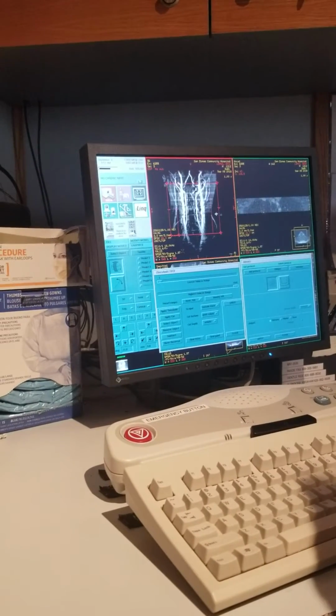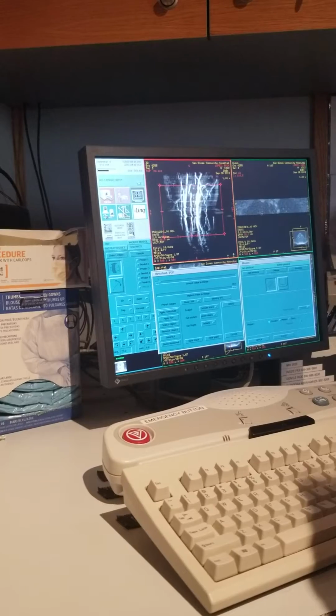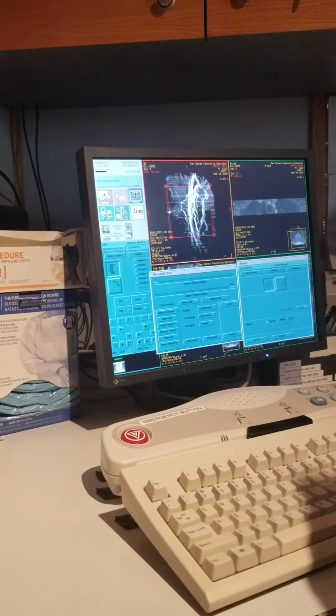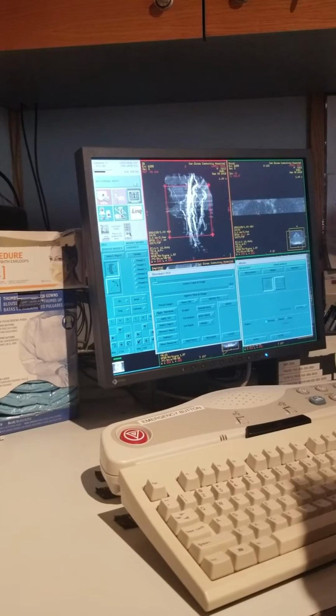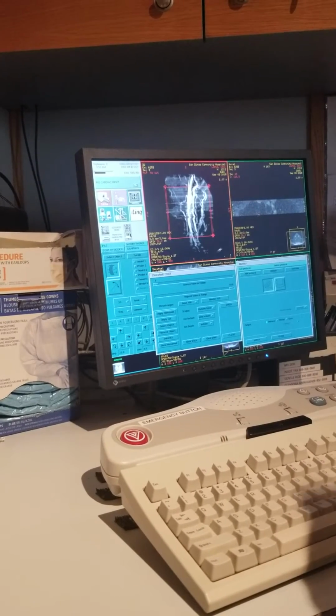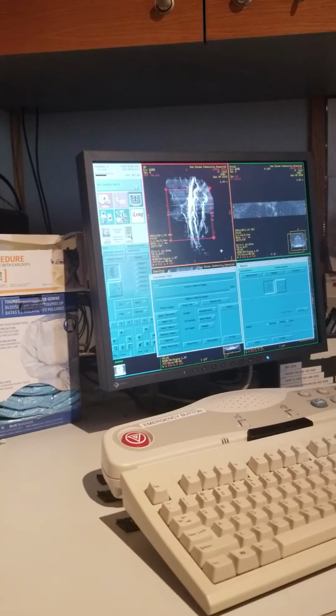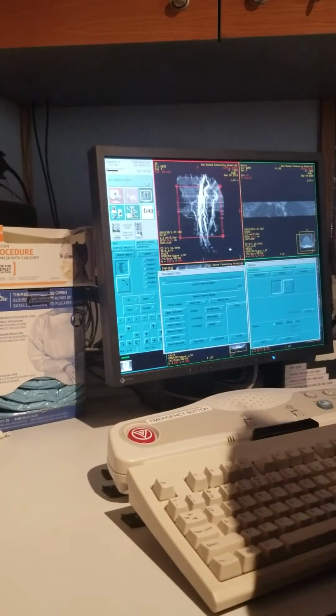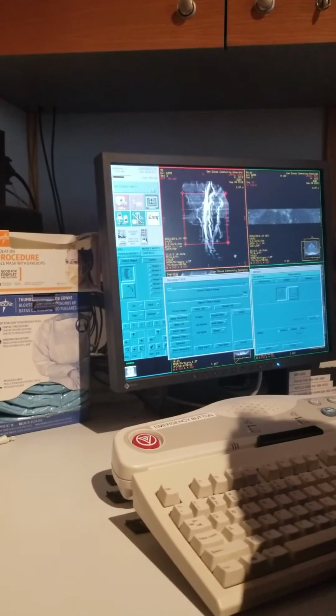That's what you're going to cut out. A lot of times at the sites, you'll rotate and tumble the complete system, and then you'll cut just the right common carotid and the left common carotid by itself, without the other side or without the vertebral.